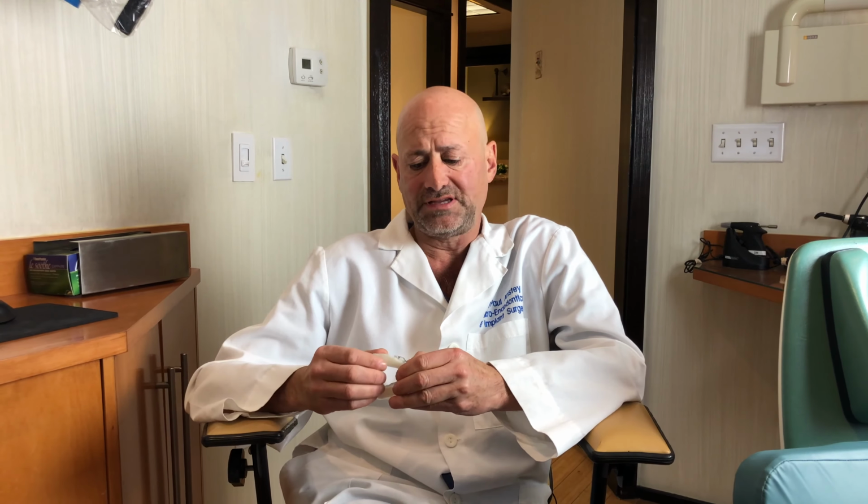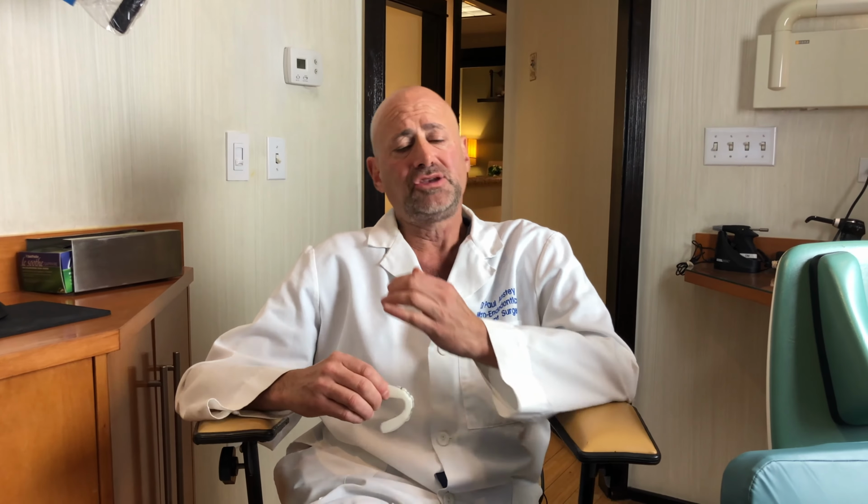It's really hard to believe, and I see it in this practice where implants are placed angled in the wrong position. Implants are placed hitting up against adjacent roots. I've had to do root canals on teeth that shouldn't have needed the root canal only because the surgeon placed the implant at the wrong angle and it basically hit the root of the tooth next door. I've dealt with cases where I've seen implants in the nerve canal, patients ending up with a numb lip that basically it's damaged for the rest of their life. So many issues that I've seen.